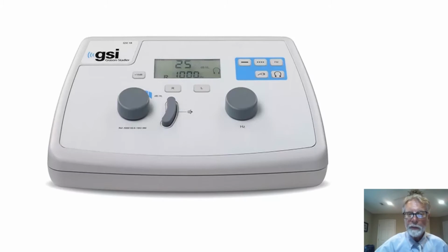Then you can see right in the middle there is a large button that you would use as your interrupter. That's the button you push to present the stimulus. Right above that there is a left and right button to change from the left ear to the right ear. Of course, we're going to do the same thing on both ears. And you can see on the display that right now we're at 1000 hertz. I don't know if you can see it, but we're on the right ear and we're at 25 dB.